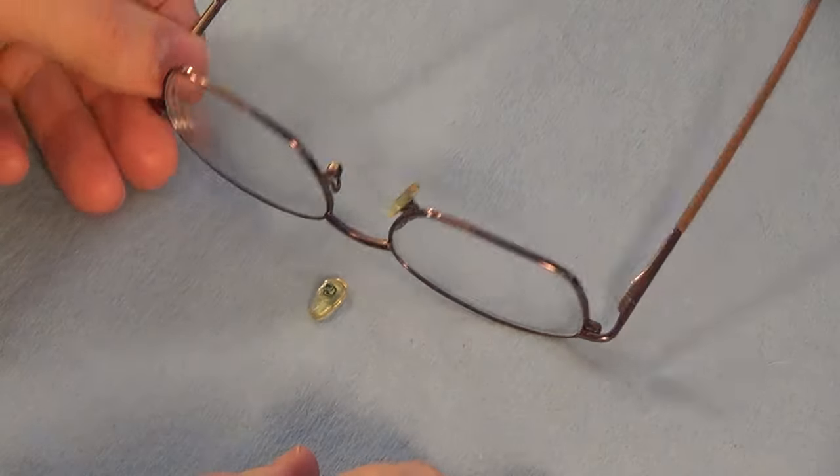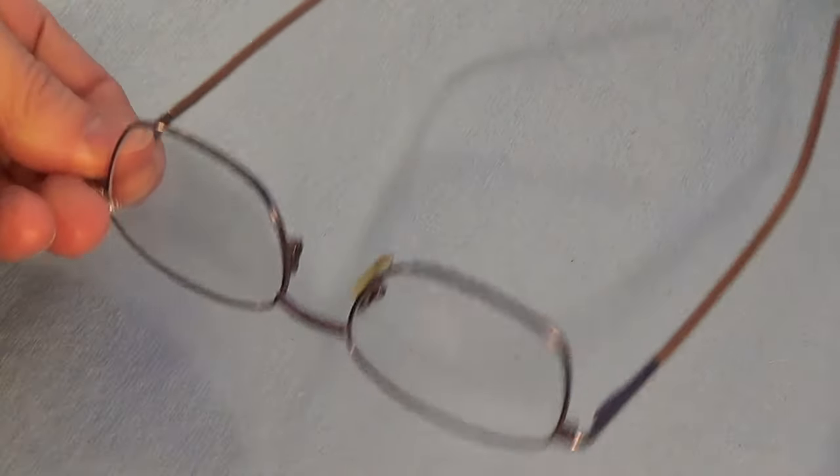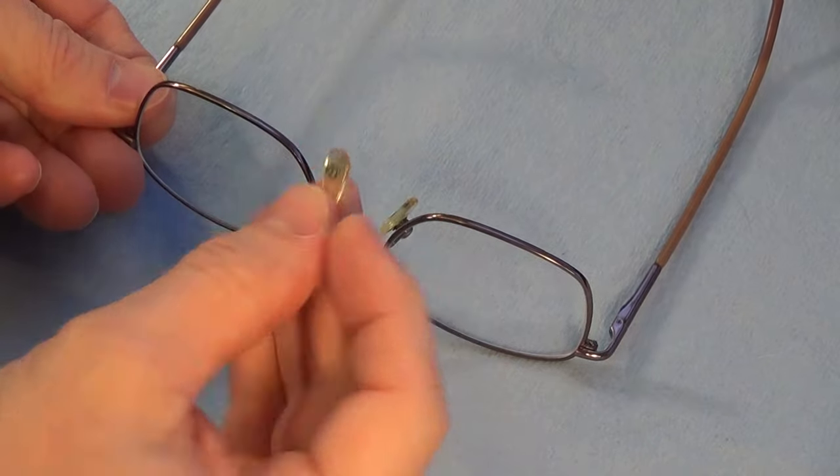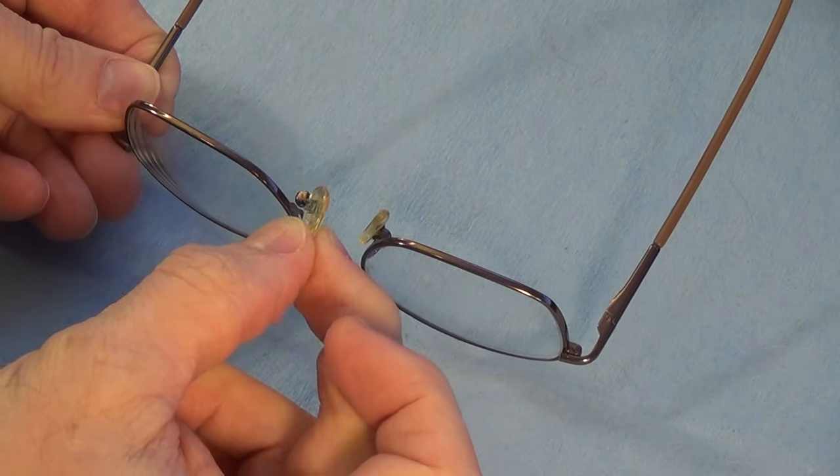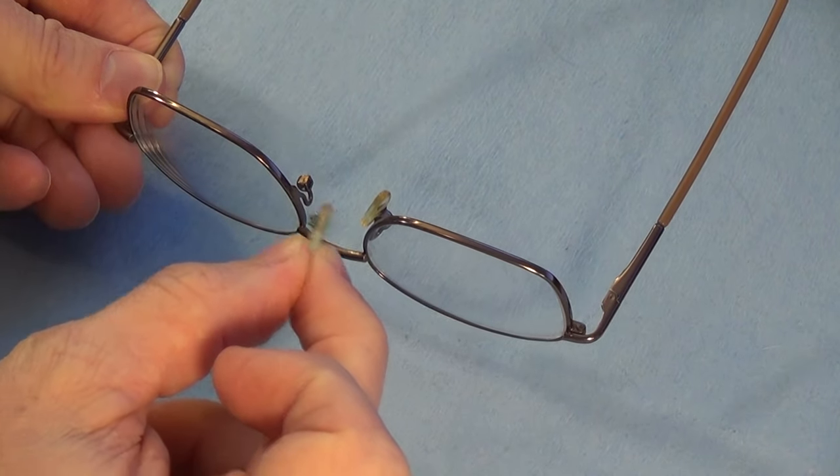Hello, this is Gio. Look what I have here — a pair of glasses where the nose pad on one side just fell off. We're going to replace it today.